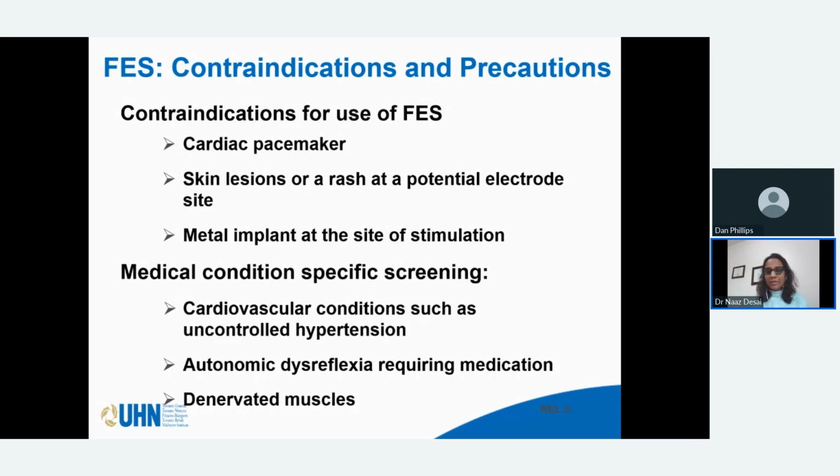So we can consult with the physician or the physiatrist and see whether or not it is safe to use FES. But nonetheless, these factors do need to be kept in mind. Then when we're talking about spinal cord injury patients, patients with autonomic dysreflexia requiring medication might require a little bit of closer supervision. And then in patients with denervated muscles, the application of electrical stimulation is slightly different.